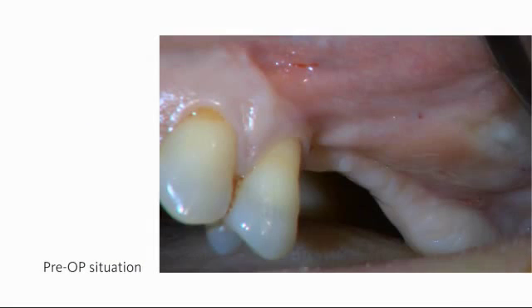This mucogingival tissue regeneration instructional case uses a strip gingival autograft and Geistlich Mucograft to gain keratinized tissue. The goal of this technique is to achieve predictable tissue gain with minimum morbidity and generate long-term, stable, favorable outcomes.